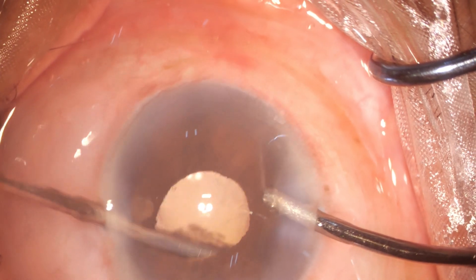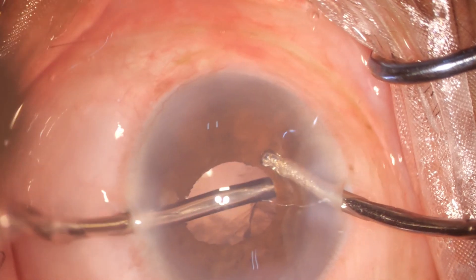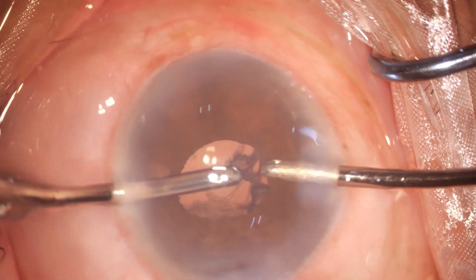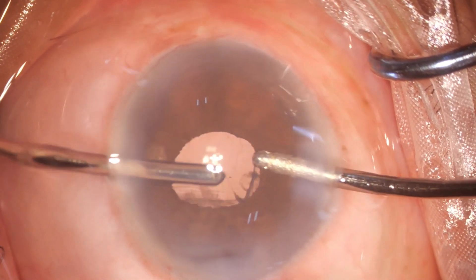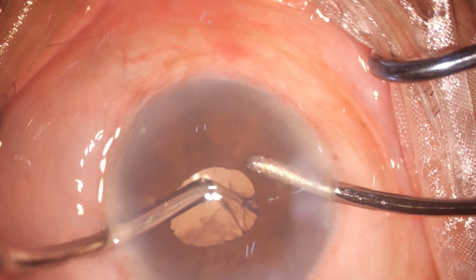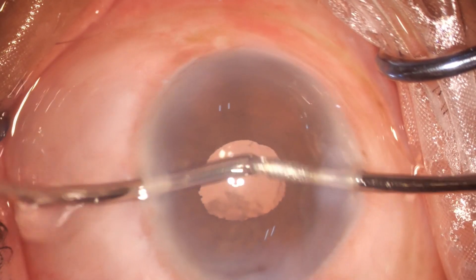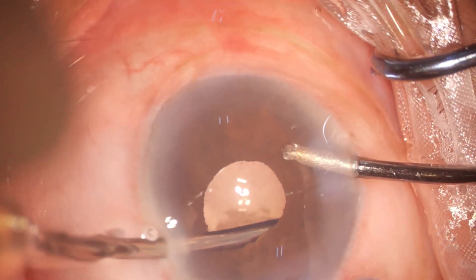Now one is trying to remove it, but you can see the capsular bag being stretched with it. The other hand with the irrigation port is trying to keep the bag in its position. The little thing you see at 6 o'clock is just PCO, not cortex.